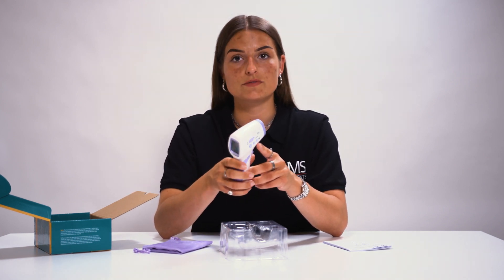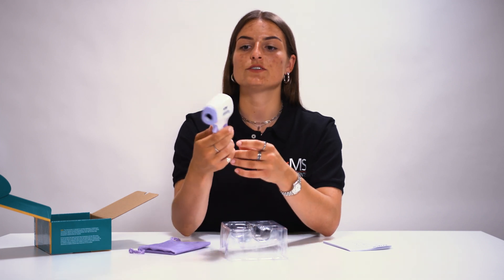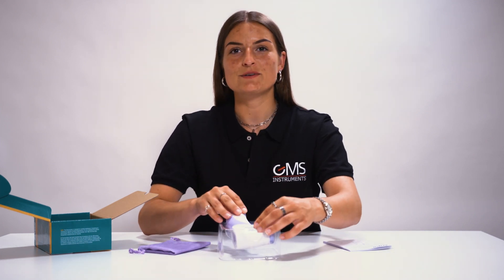Let me show you how to use it. You have to point this device at the forehead from 15 centimeters distance, and then push this button. Like this. Within 0.5 seconds, you'll see the measured temperature. As you can see, it's 36.7 degrees Celsius. So I think I'm doing just fine.